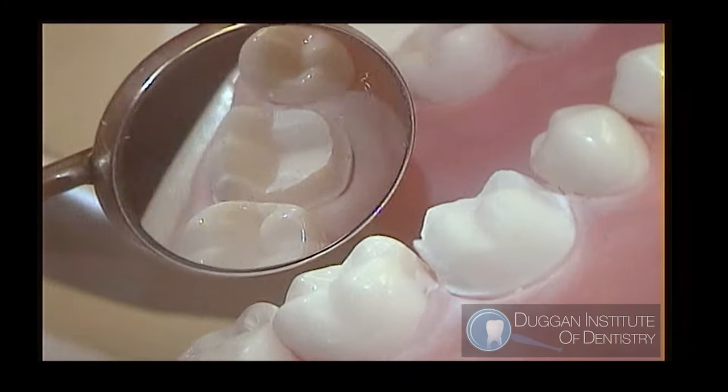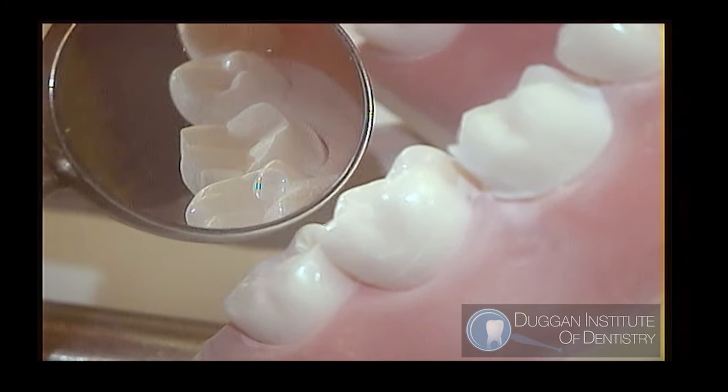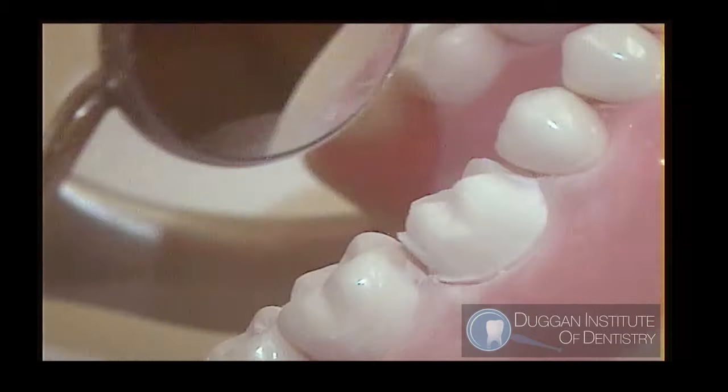Place a secondary plane on the occlusal 1/3 of the lingual surface.